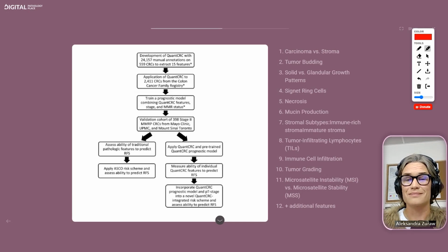And I'm completely naive about these things, but allowing the machine to learn rather than telling the machine what is and what isn't, just allowing the machine to be taught rather than the way it used to be done. And now there are several programs that get very good correlation between the algorithmic quantitation of eosinophils and the human quantitation of eosinophils.